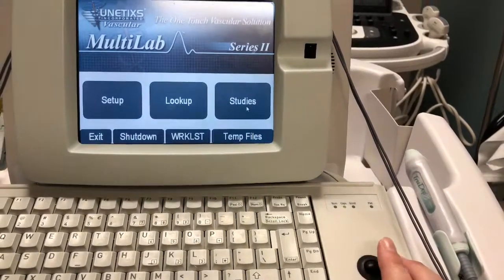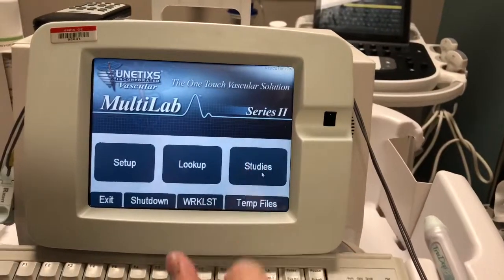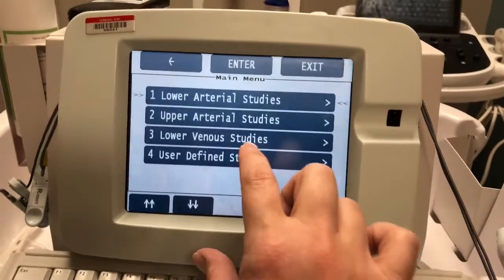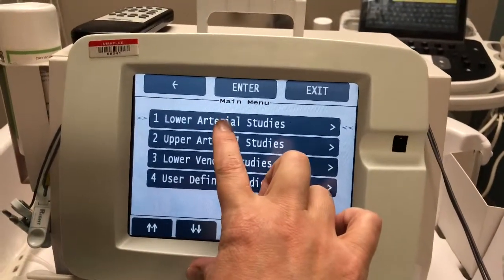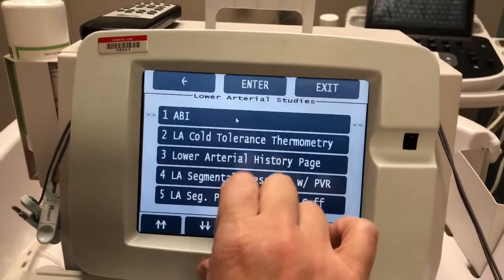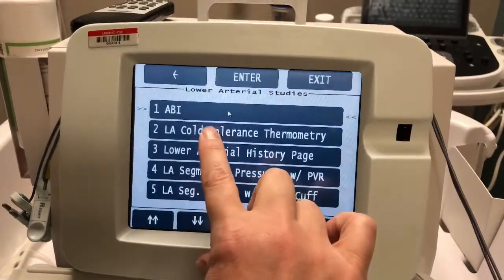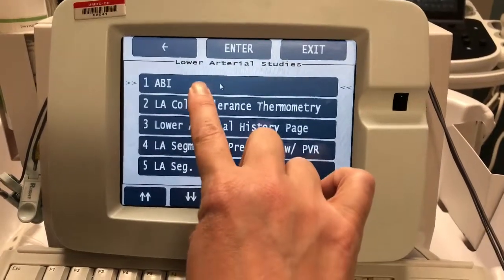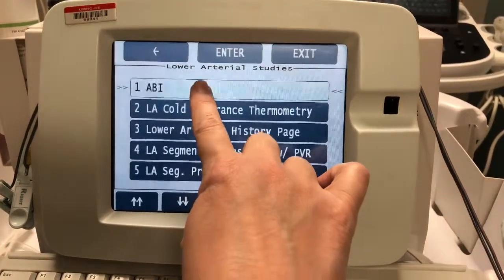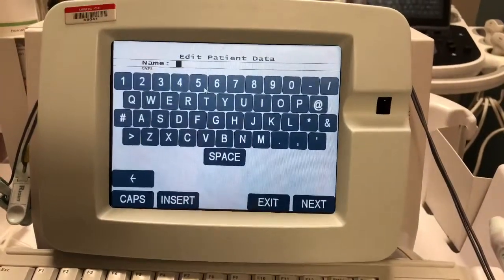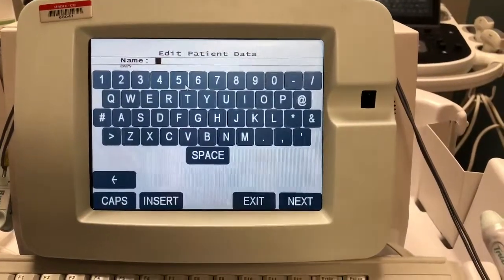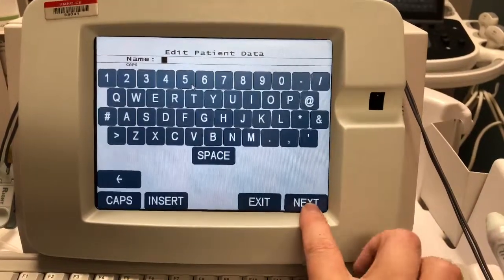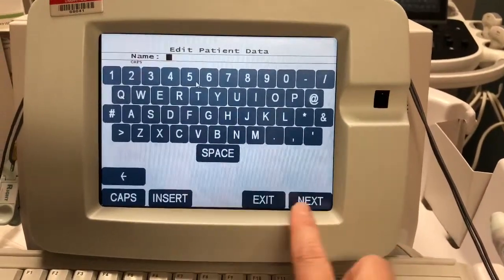Today we will go to Studies and we will be using the lower arterial studies and use the ABI. These are some of the options that this machine can do for you. This is where you would type in the patient's name, but for our study today we're just going to put 'test.'